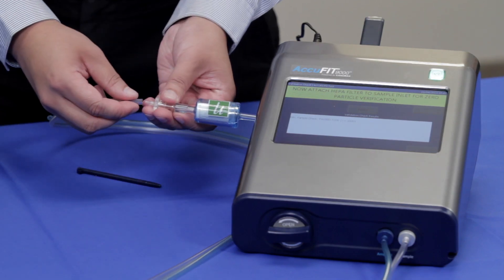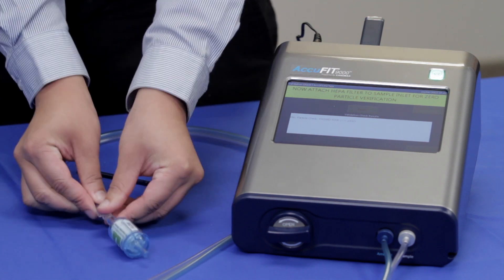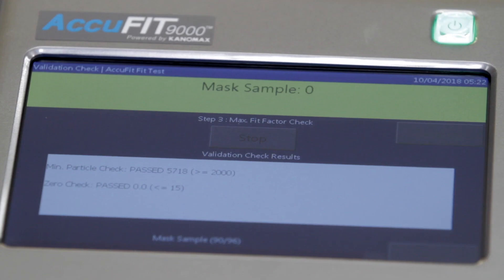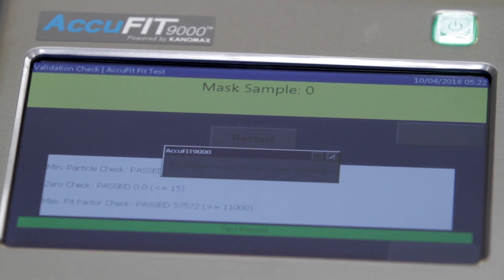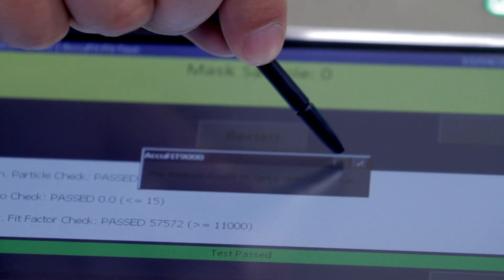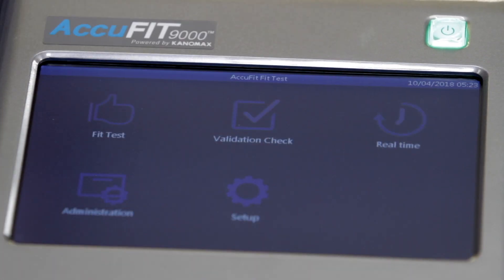When this is complete, proceed to the zero check by attaching the HEPA filter and tap Next. When the zero check is complete, the AccuFit will calculate a fit factor with the HEPA filter and provide a test passed message. The validation check is automatically saved to the database. Tap OK, then tap Exit to proceed to the main activities menu.